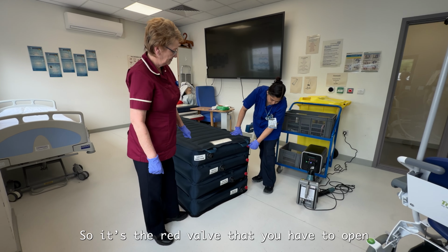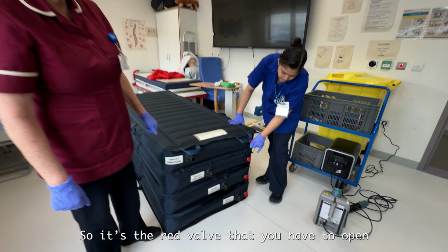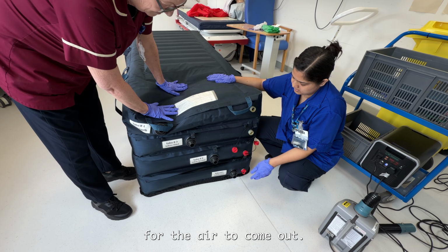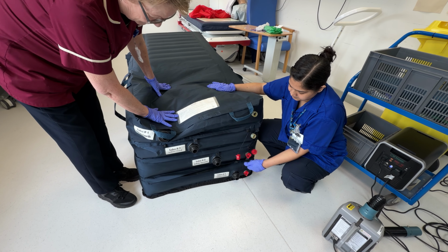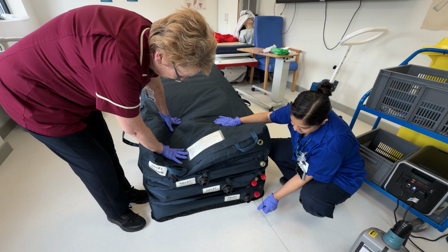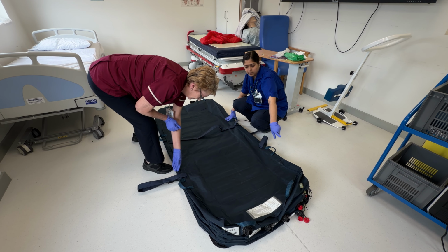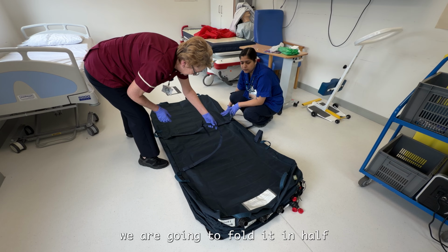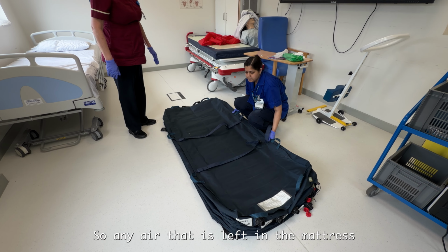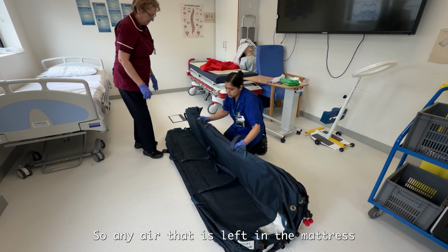So it's the red valves that you have to open for the air to come out completely. So we have opened the red valves of the hover mattress and we are going to fold it in half. So any air that is left in the mattress will be easily out.